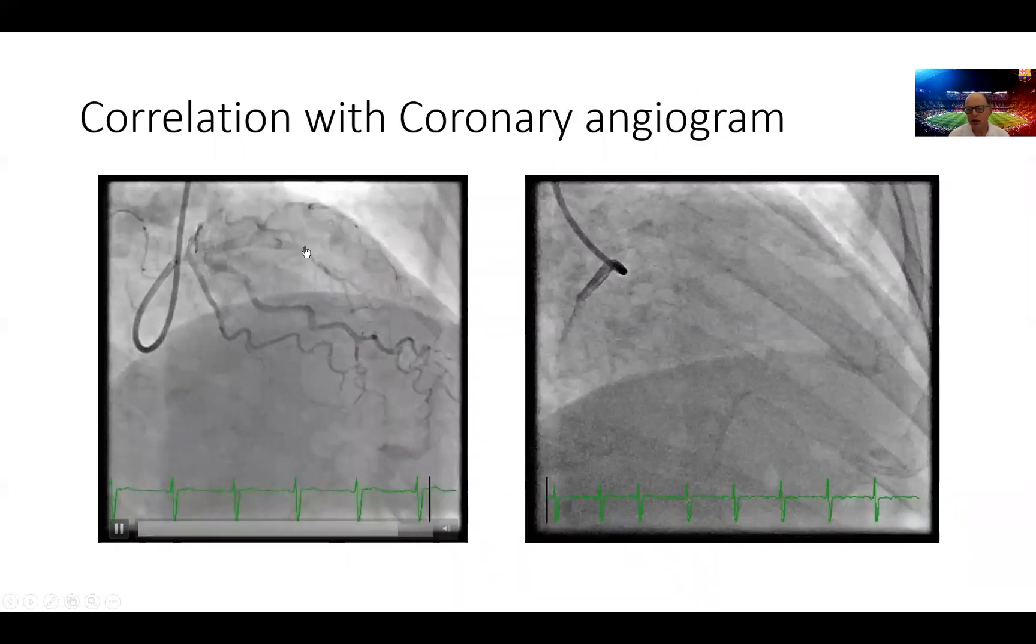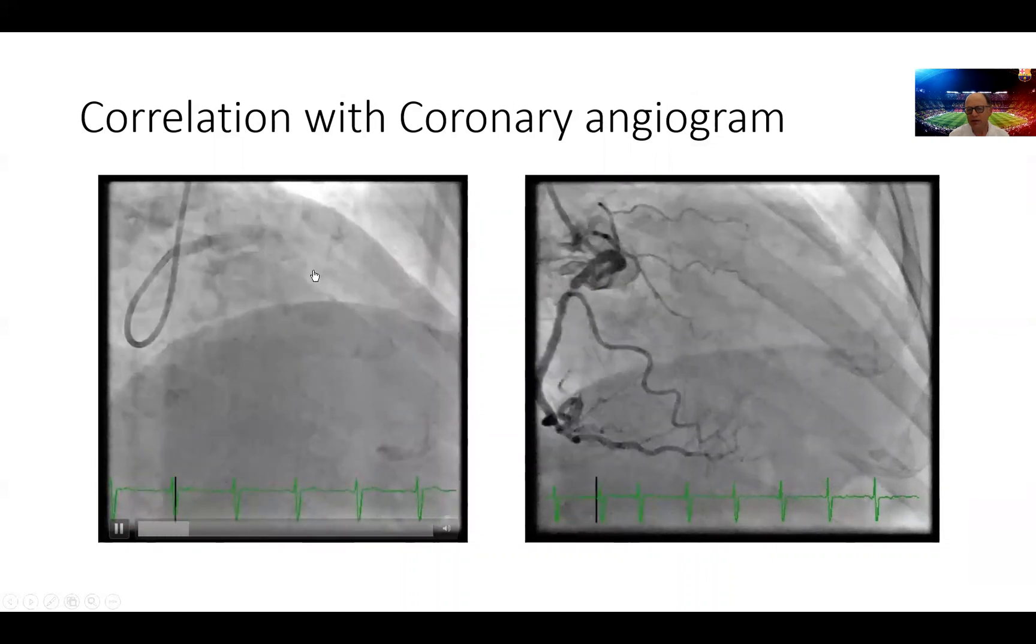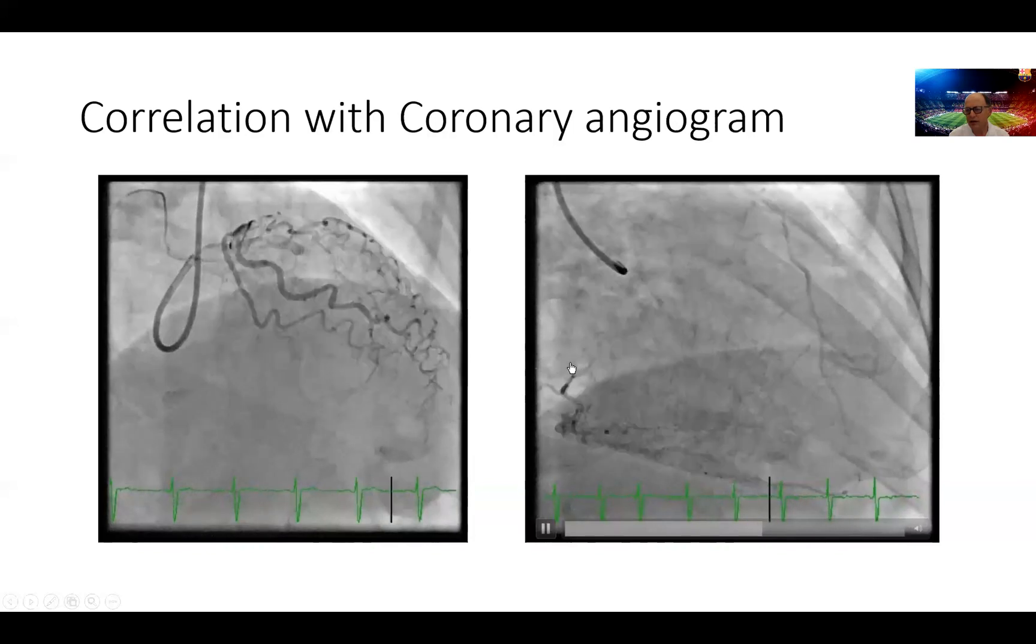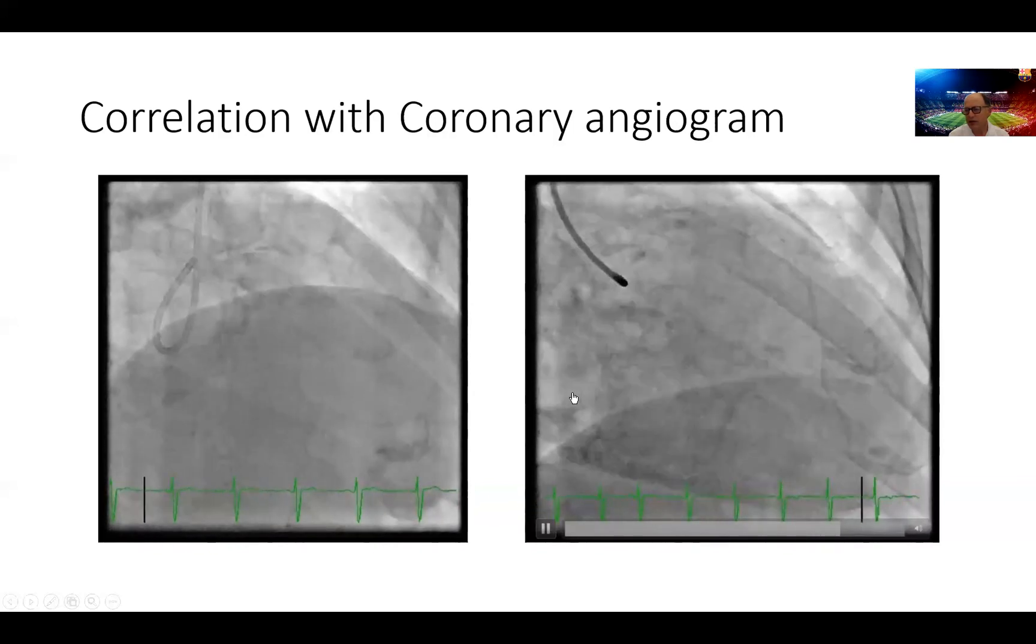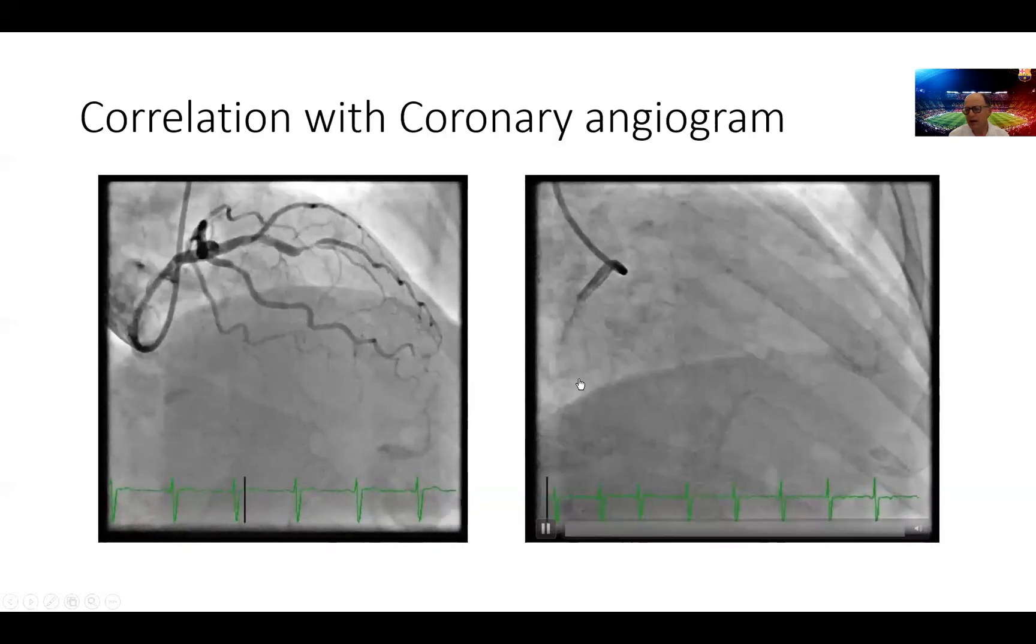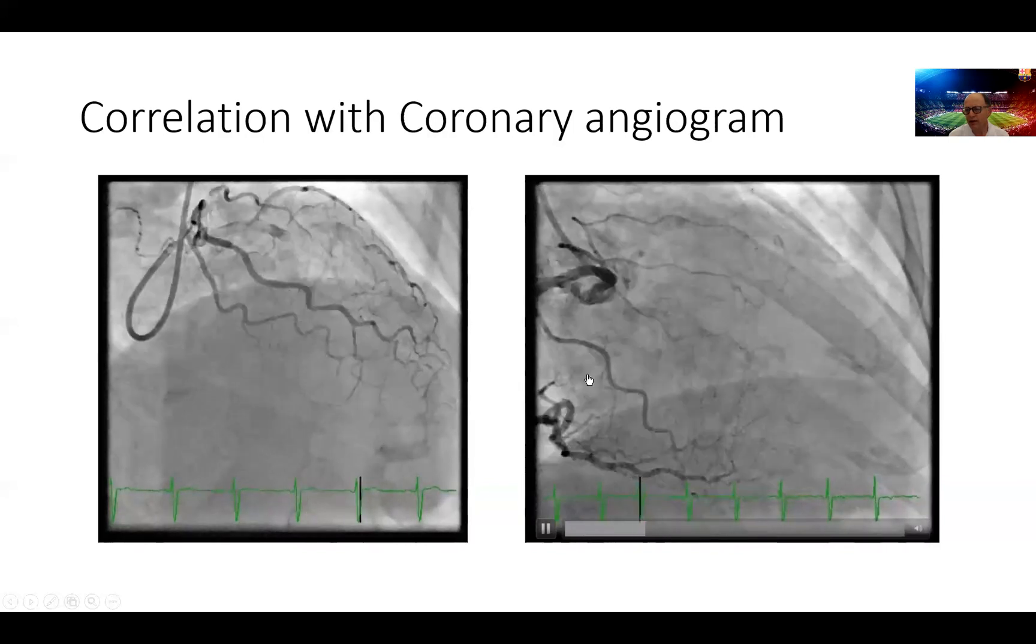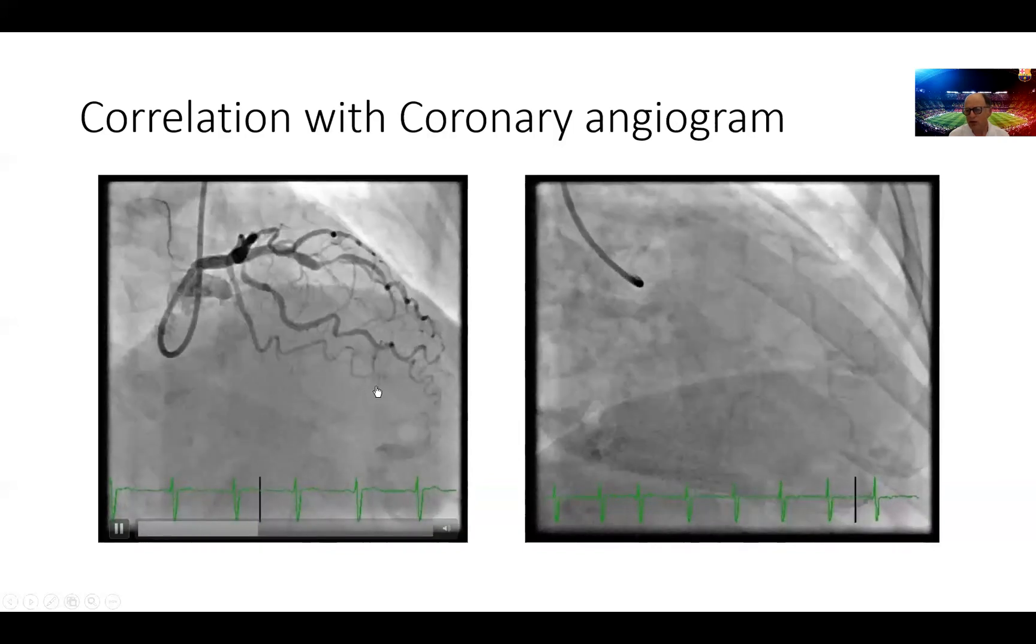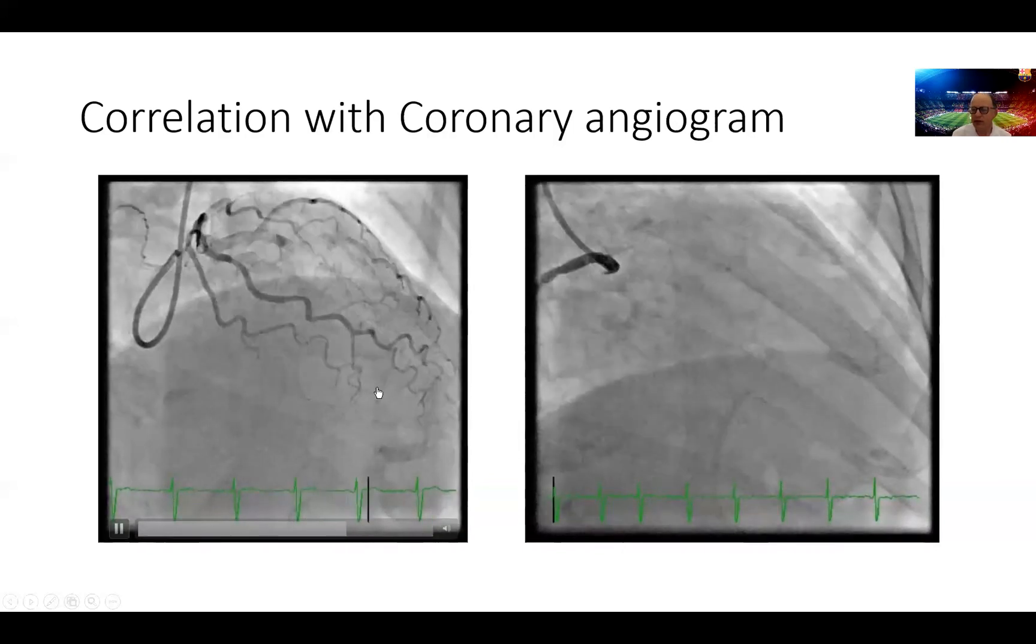That's the cardiac cath on this patient showing a significant severe lesion in the left anterior descending artery here, as well as another significant severe lesion in the right coronary artery right here.